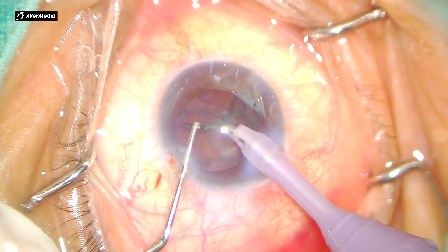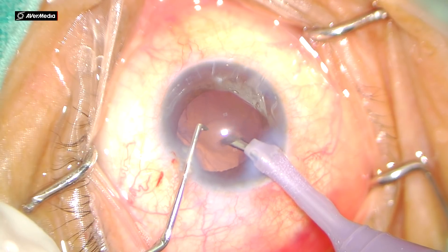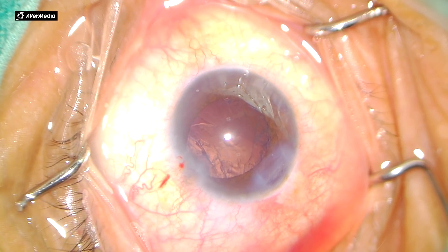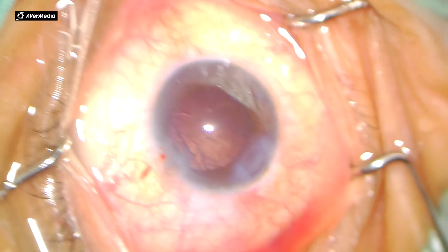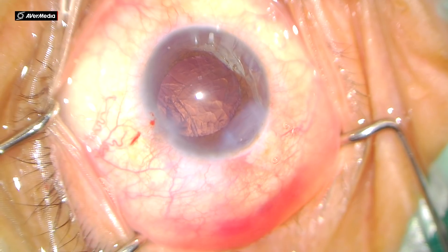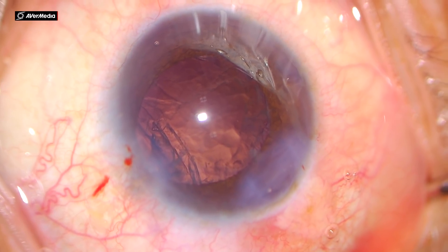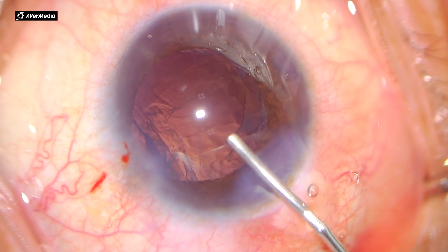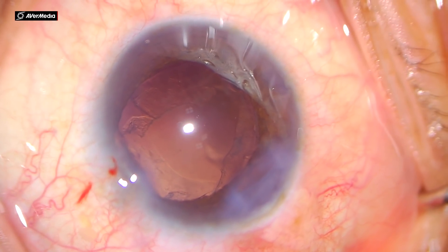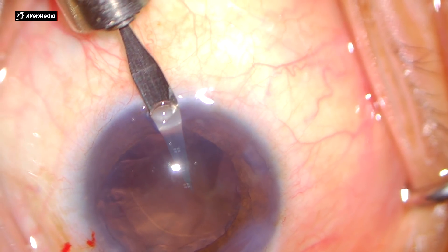After completing the phacoemulsification of the nucleus, you can see there is a blood clot at the side of the side port — I will be telling its significance later in the video. When I completed my phaco, some laxity of the capsule was visible. I realized I had caused zonular dialysis, so I changed my magnification to a higher level and injected visco to inflate the bag. That hemorrhage is again seen beautifully — we will come to its significance later.